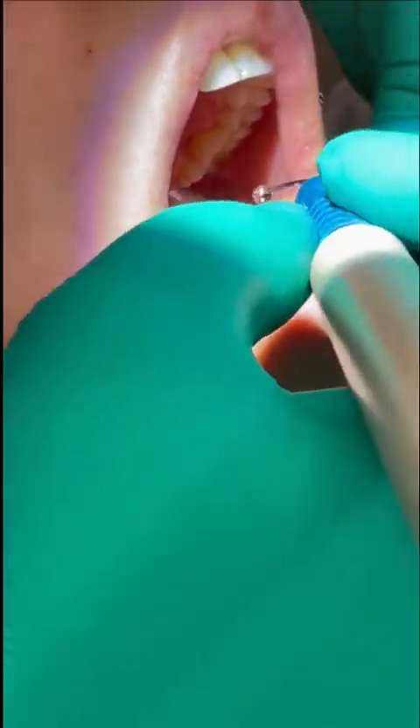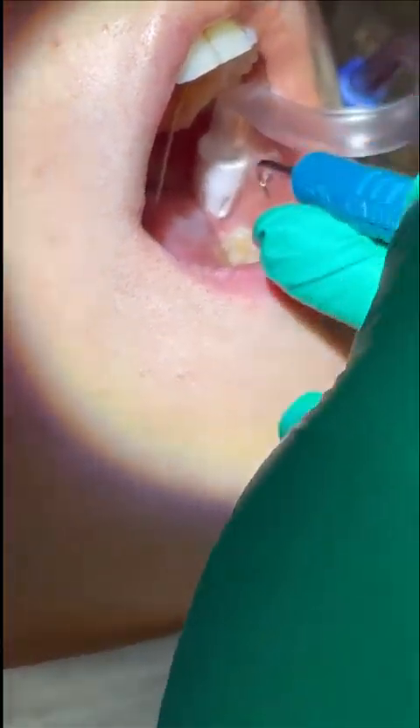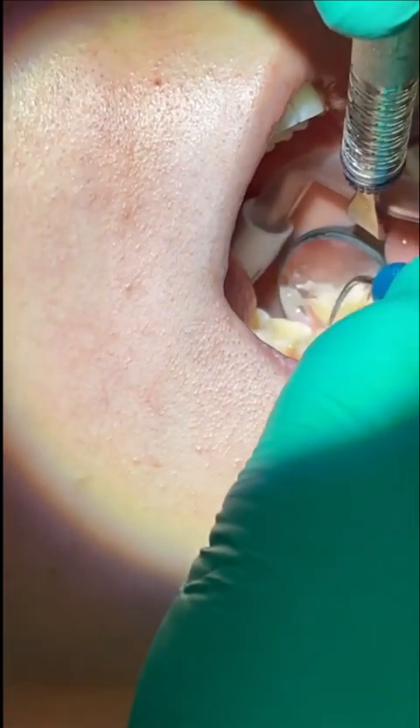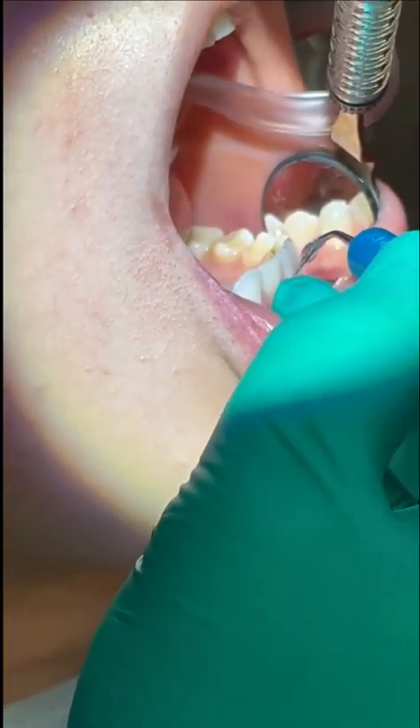Then I'm done with that upper left quadrant, and I'm ready to move to the lower quadrant on the same side. I quickly reverse the bends in my suction, and then start on the posterior teeth in much the same way as I did on the upper. I will use indirect vision on surfaces away from me, and when I get to the canine, I again will move to the 12 o'clock position for the anterior teeth.